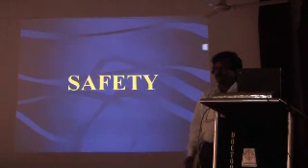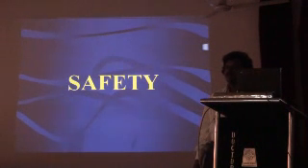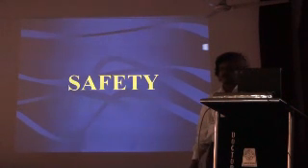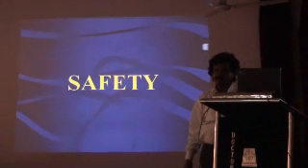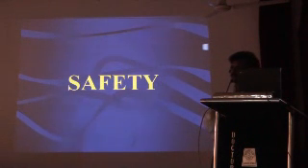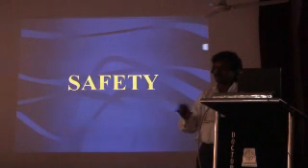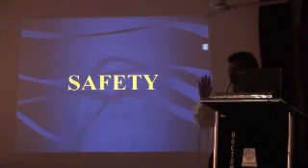The important aspect is the cochlear implant. The patients having a cochlear implant, this is a very costly instrument, and the procedure takes a long time, a lot of manpower. Naturally, the cost is much more. If the patient has a cochlear implant, he can't do it. A patient with metallic sutures or staples from a recent operation, this is not a contraindication. It will produce some local heat generation, but it is not a contraindication.